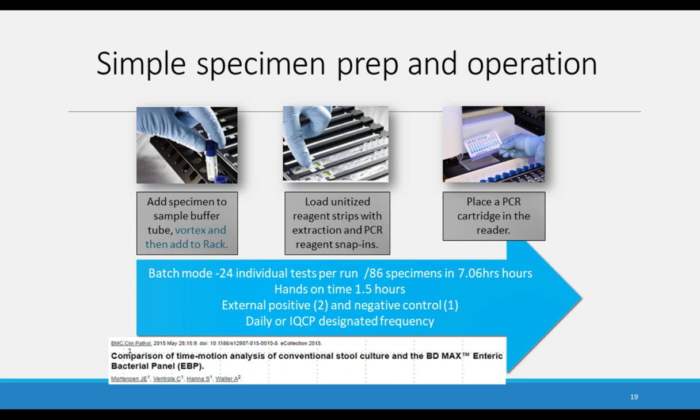Of course, you have to do quality control in any molecular process. There is an external positive and negative control that must be done with this assay. Of course, you can do daily QC if you wish, or you can do an IQCP type plan and have a designated frequency established for doing your QC.